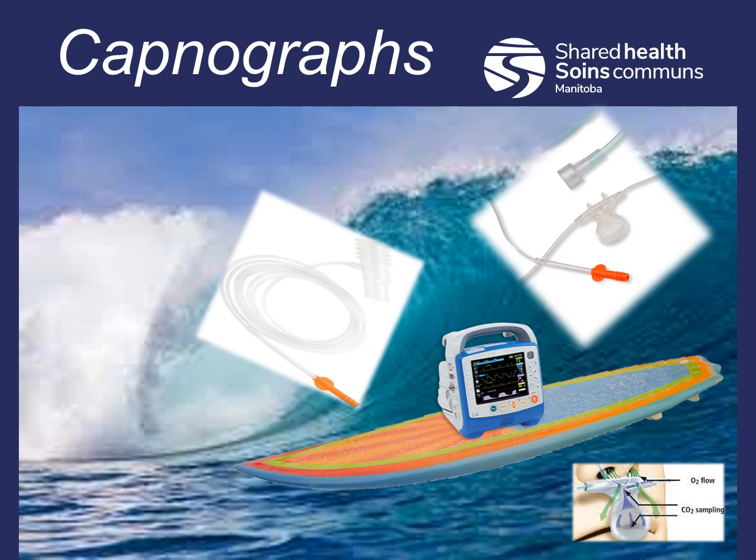The nasal sampling cannula that we have on truck is very versatile. You can use it on its own without administering any oxygen, or while you are delivering oxygen to a patient via the nasal cannula. Or I want you to consider using that nasal sampling cannula while you have an NRB on that patient. It can sit nicely under that NRB, and the extra O2 that's being delivered from the NRB will not affect the end-tidal results at all.